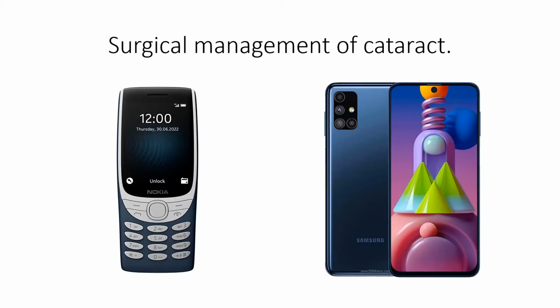So when we talk about surgical management of cataract, I put forward these two images. One is a conventional feature phone and other is the smartphone. As we all are aware, both devices can do the same basic task of making a call and communicating to the world and also take photographs, but still smartphone has its own value added features which we all prefer to use.